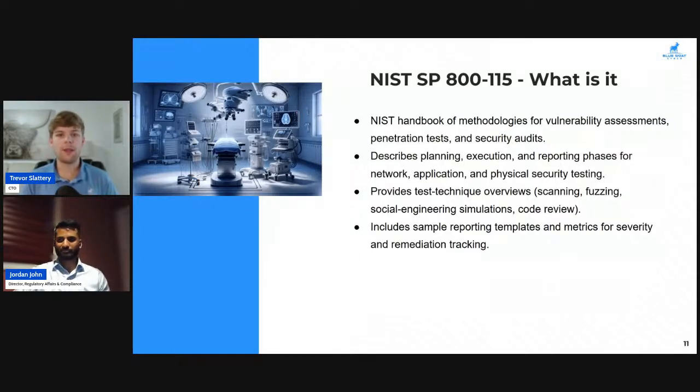We can get into network, application, and physical security testing, not all of which may necessarily be applicable to any one specific medical device. However, medical devices can be such broad categories of technology. We can have purely thin client or thick client, so that'll be like a desktop binary or a web application medical device. We can have physical devices with minimal software concerns, just something small running on a microprocessor with a single functionality. We can have these huge combination systems with a mix of both. So it's good to have a bit more of a general standard that talks about the process for doing a penetration test and an assessment, as opposed to the specific testing cases that we need to use.